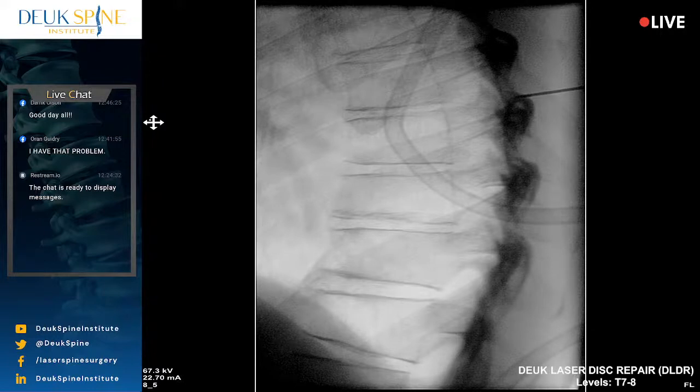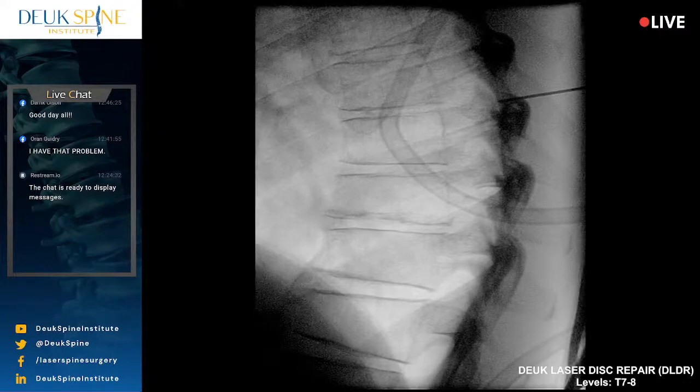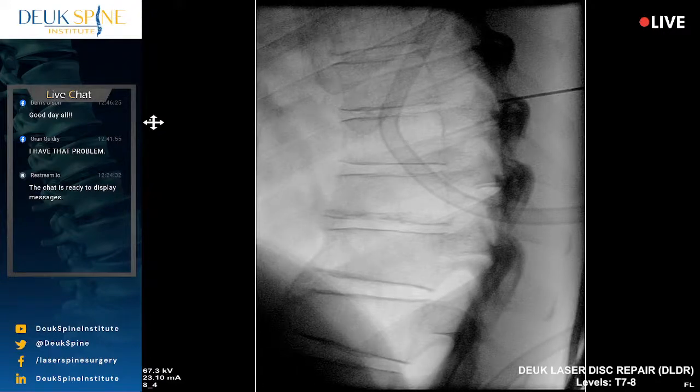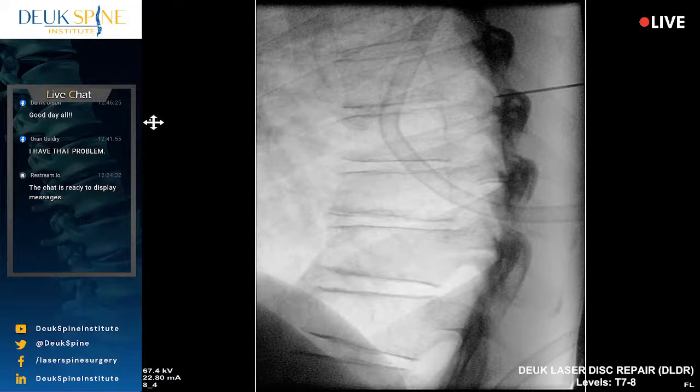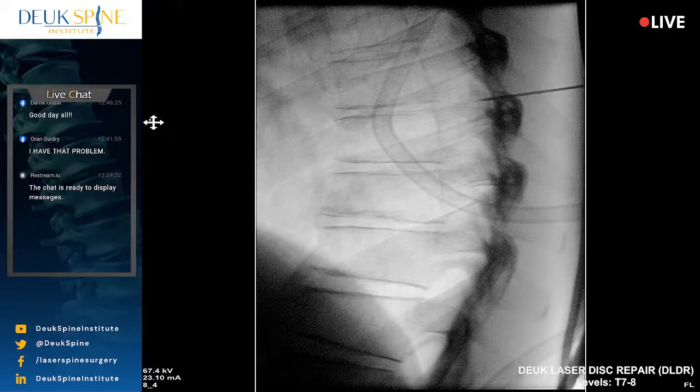You comfy? All right. Shot, you're doing fine. Just relax. Shot. Shot.